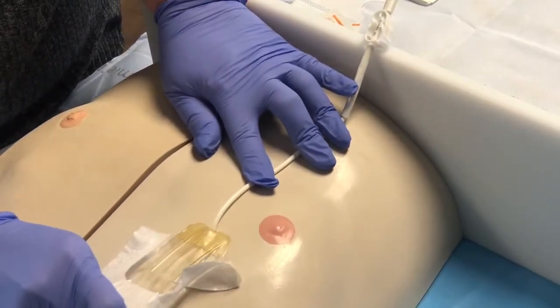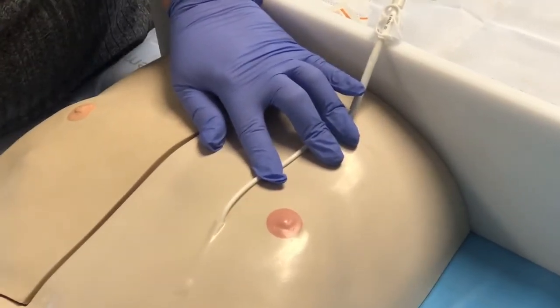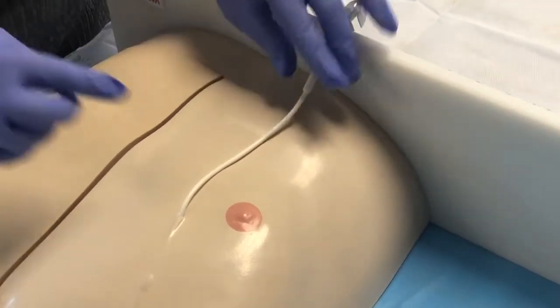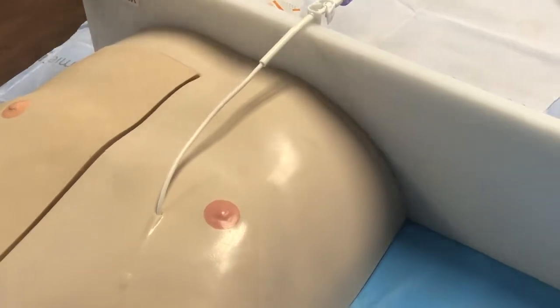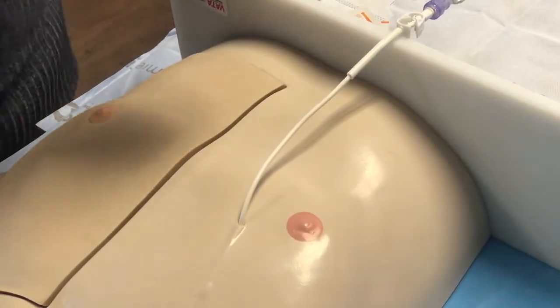Once the dressing is removed, carefully inspect the insertion site again. If there is a stat lock in place, remove it carefully. If you've used steri strips to secure the catheter, remove them now, taking care not to dislodge the catheter. Remove your gloves and perform hand hygiene.